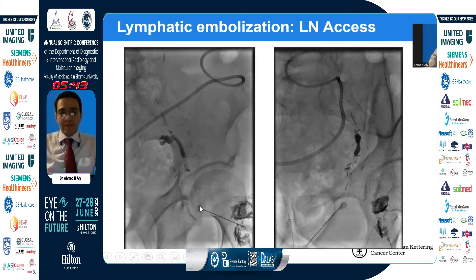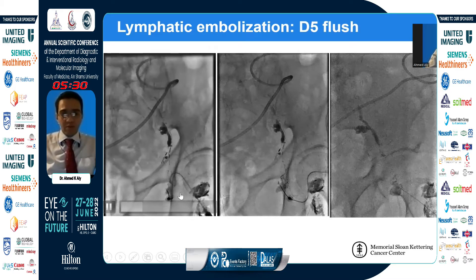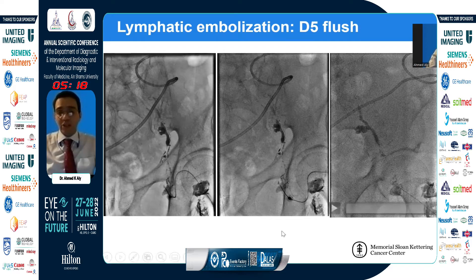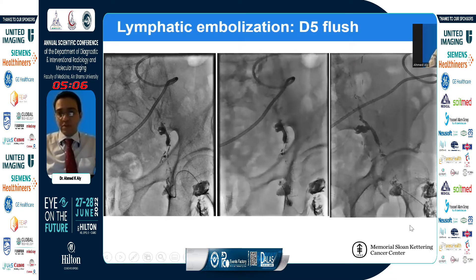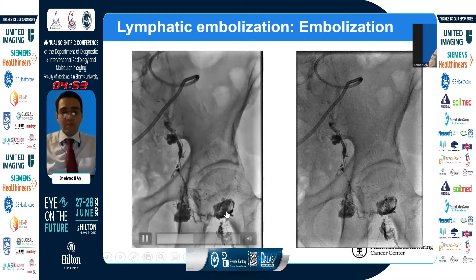We access the lymph node closest to the leak and use a double oblique view to confirm the tip is within the lymph node. We confirm by injecting lipiodol to see it fill the lymphatic vessel going toward the leak. Before embolizing, we inject D5W at our location and monitor its effect on the lymphatic vessels — it pushes the contrast out. You must flush with D5W to avoid premature polymerization of the glue you're going to inject.